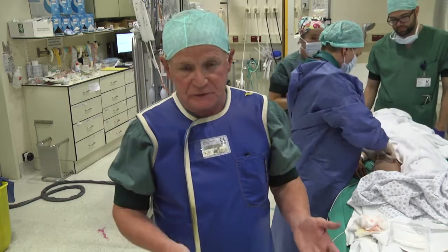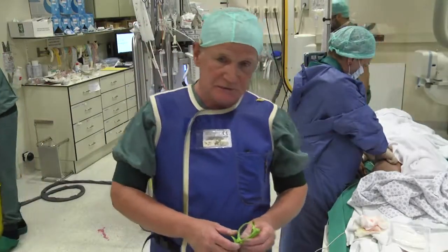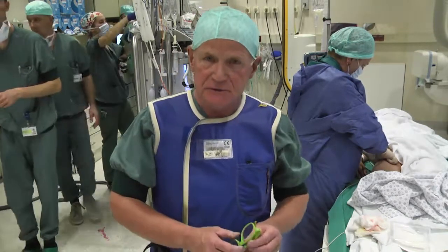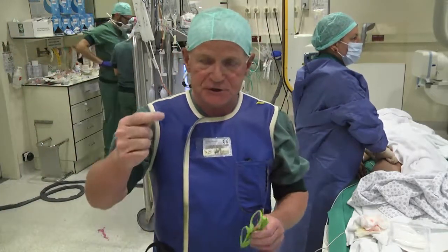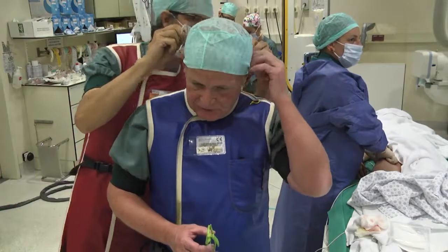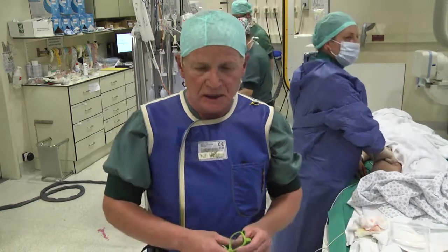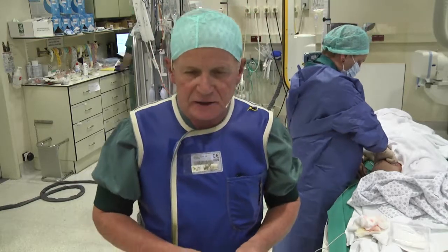I haven't seen problems with the groin. I haven't seen problems with the vein. And the way we close it, we neutralize the heparin at the end of the procedure, but before I take everything out. And then we typically put one Donati suture. I don't know if you are acquainted with that technique, but you go with a needle deep, and you come back superficial. So with one stitch you have both the skin and the deep compression, and we remove that stitch after 1 week, and I must say it gives a good hemodynamic and a very good aesthetic result.